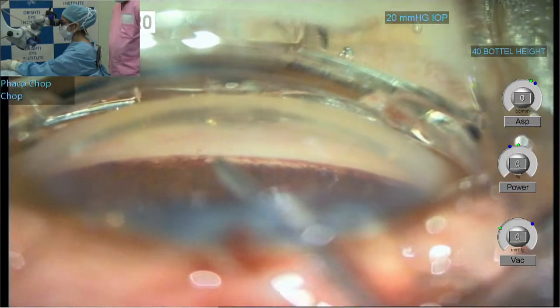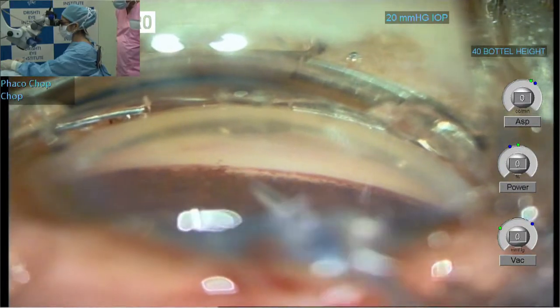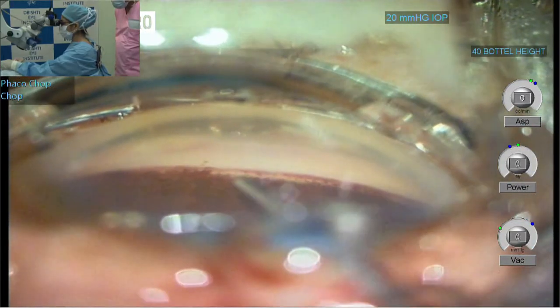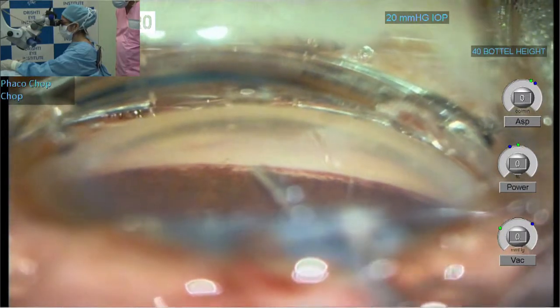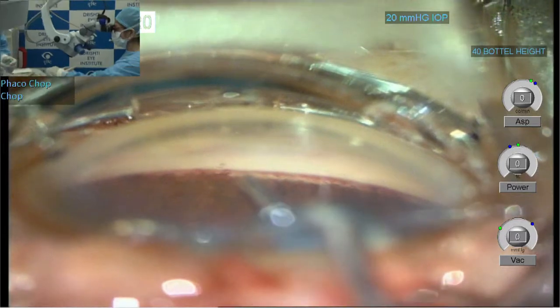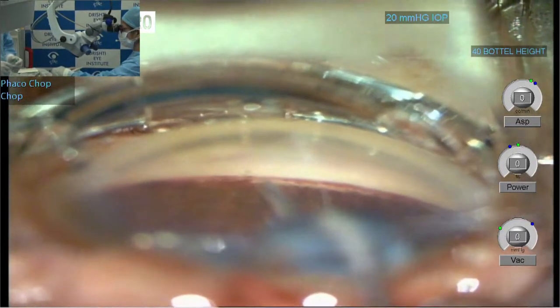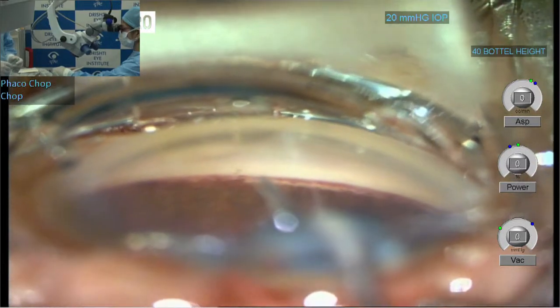So when I enter the eye, this is how it looks. This is the insertion sleeve. If I pull it back, I'm able to see a trocar. This is a pointed tip over here. Is that visible to everyone? And just within that, I can see one iStent inject.